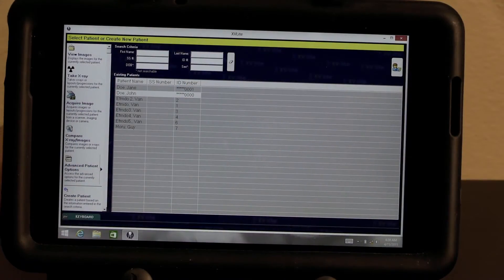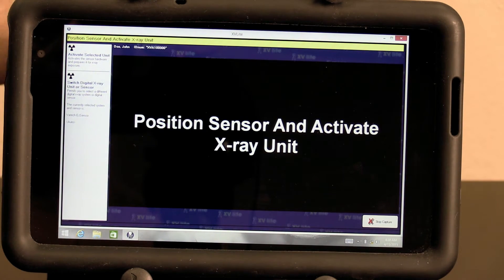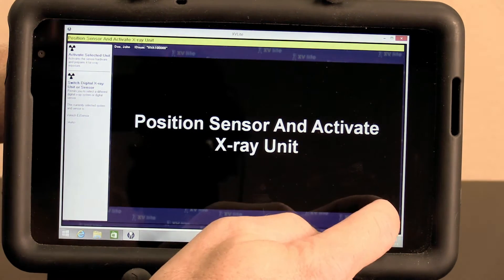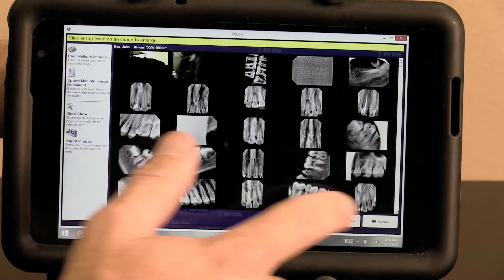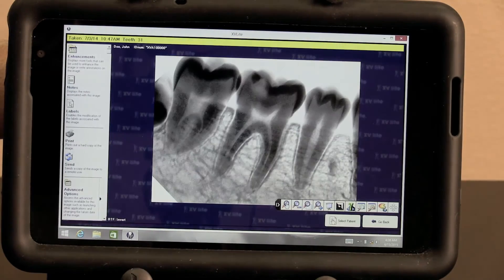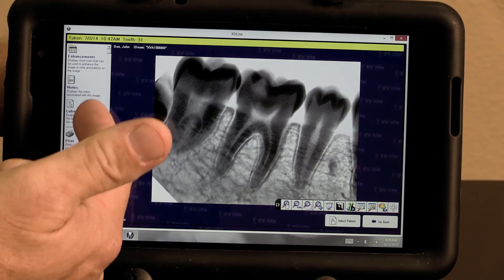This unit comes with extremely easy-to-use software. Simply select the patient, hit take x-ray, select the range of teeth you want to image, position the sensor, and take the image. Once you've captured the image, you can review images by hitting view images, view images for all teeth, and then individually review every picture taken for that client. You can invert photos, enlarge photos, reduce photos, and do everything you would normally do with a regular digital program — save, email, and send photos.